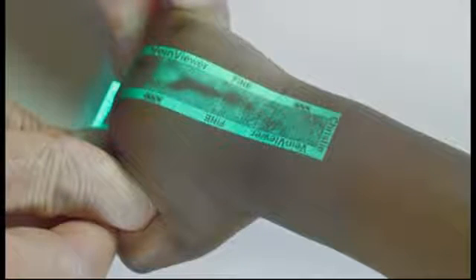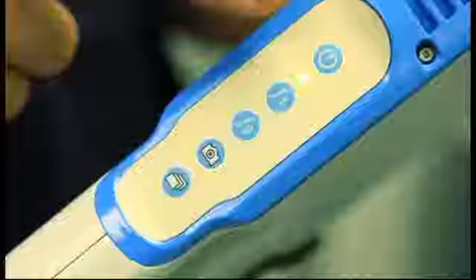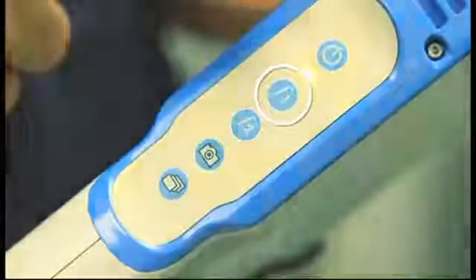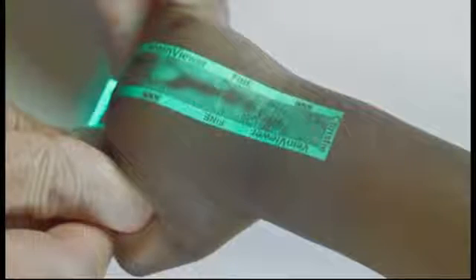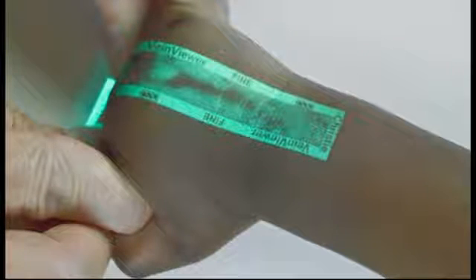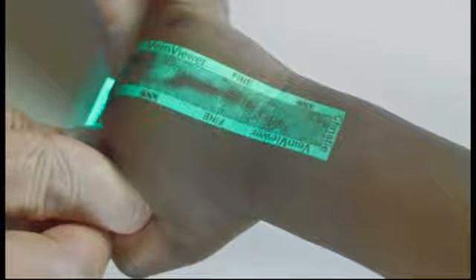The optional resize feature allows the window of the Flex image to be set to three different sizes. Once this mode has been purchased and unlocked, press the function button you have assigned to the feature during product setup. This feature is also helpful with pediatric or neonatal patients where you wish to more carefully focus the VainViewer image on a smaller appendage such as an arm or leg.